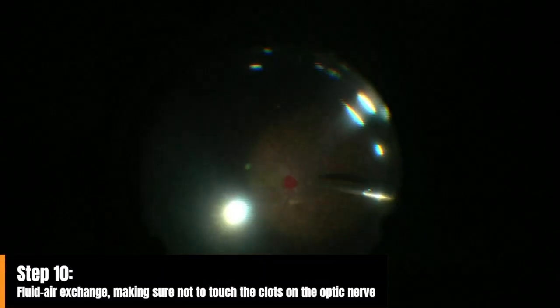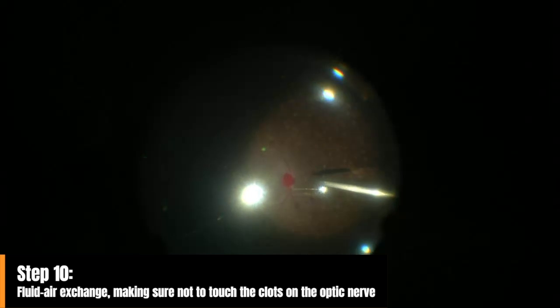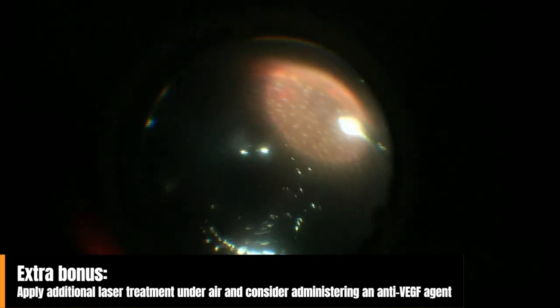Now the final step will be to perform the fluid air exchange, making sure not to touch the clots on the optic nerve. Leave them alone, the clots will disappear slowly with time, and if you remove the clots at the end of the surgery, you can cause rebleeding.